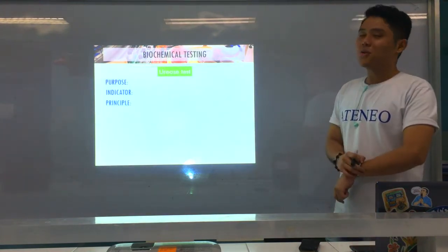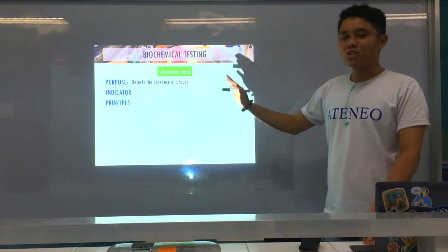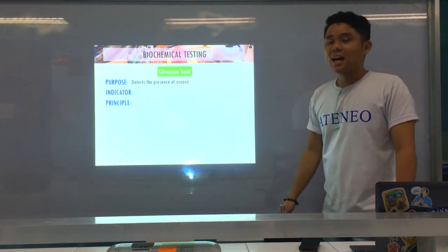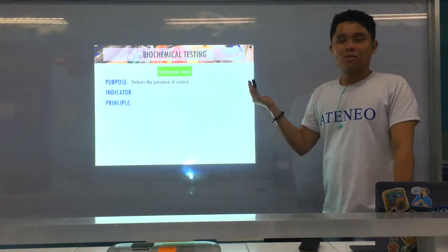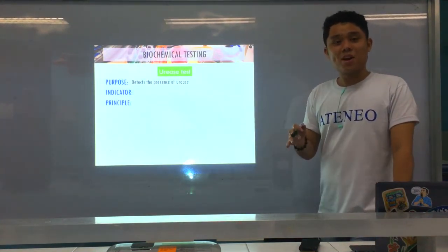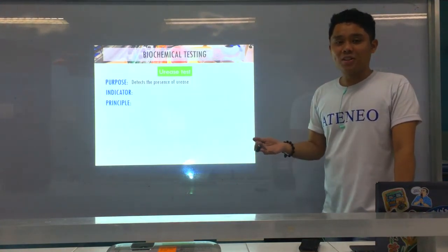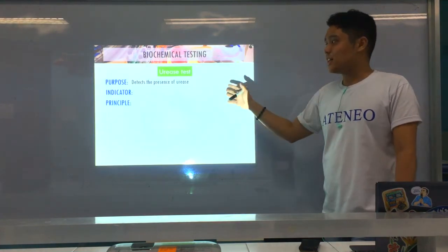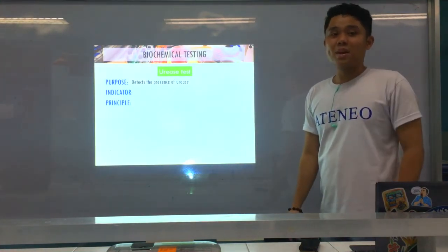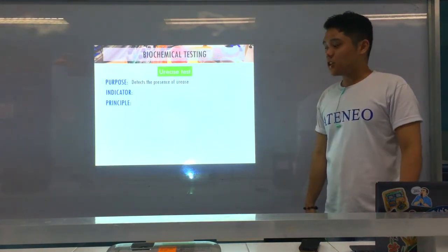And the last test for our Enterobacteriaceae is of course the Urease test. Again, as mentioned, it's not only found in the Enterobacteriaceae. It can also be used for other bacteria. Remember, which test differentiates C. diphtheriae, Corynebacterium, from others that can produce a brown halo on CTBA, C. ulcerans and C. pseudotuberculosis? It's the Urease test, because Corynebacterium diphtheriae is urease negative. So again, it detects the presence of urease.